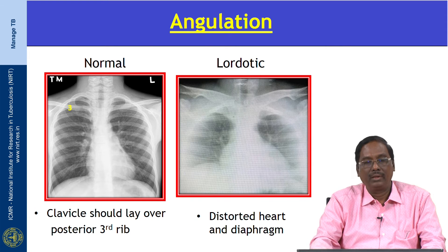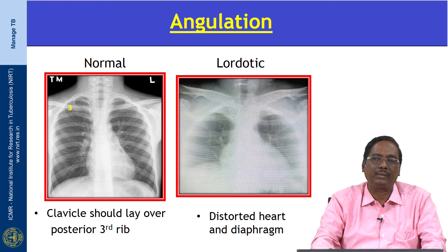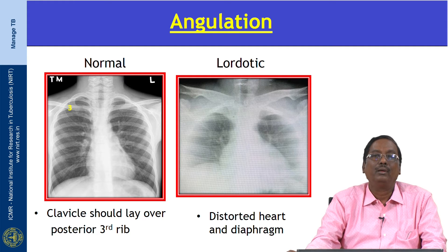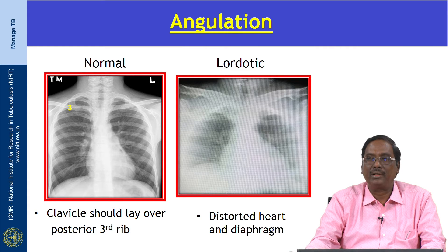Angulation: in a properly angulated X-ray, the patient stands erect and the X-ray passes from posterior to anterior in a horizontal line without any angulation either tilted up or down, centering at T5. In a properly angulated film, the clavicle should lie over the posterior third rib. This is a lordotic view, where the X-ray tube has been tilted up, producing distortion of the heart and the diaphragm.